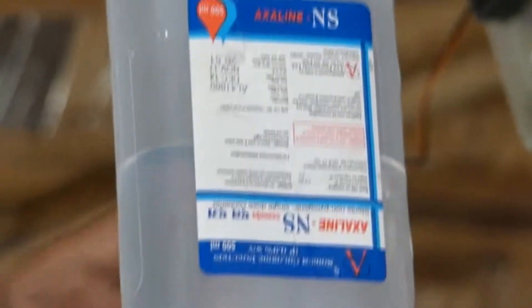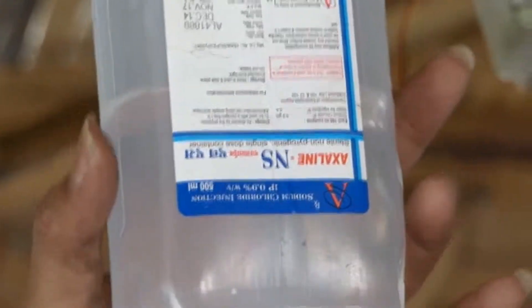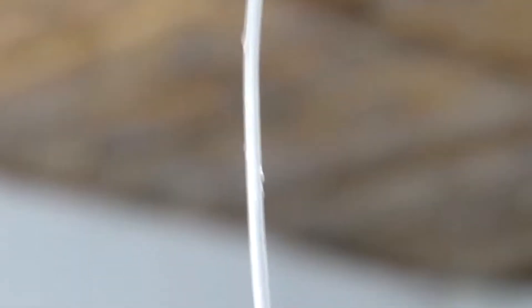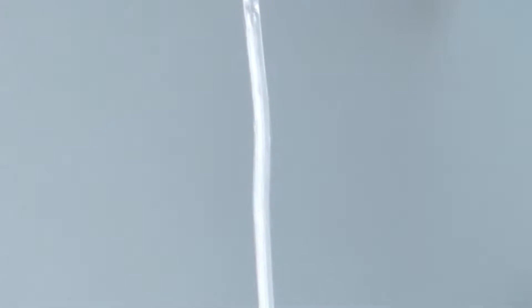Okay, this is a normal saline bottle and this is the infusion control set. This is the control valve, and this is the needle which goes right into the patient.